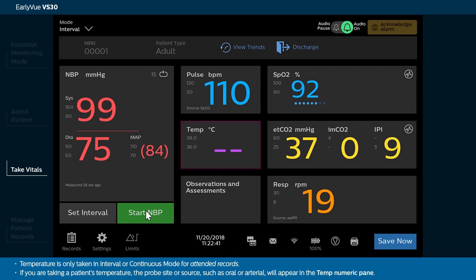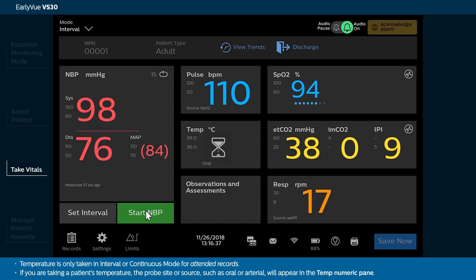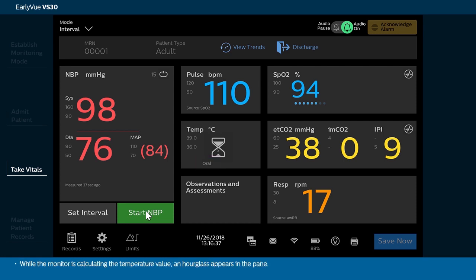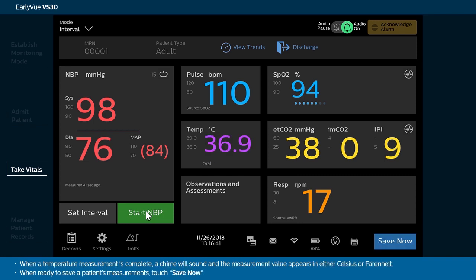Temperature is only taken in interval or continuous mode for attended records. If you are taking a patient's temperature, the probe site or source, such as oral or arterial, will appear in the TEMP numeric pane. While the monitor is calculating the temperature value, an hourglass appears in the pane. When a temperature measurement is complete, a chime will sound and the measurement value appears in either Celsius or Fahrenheit.